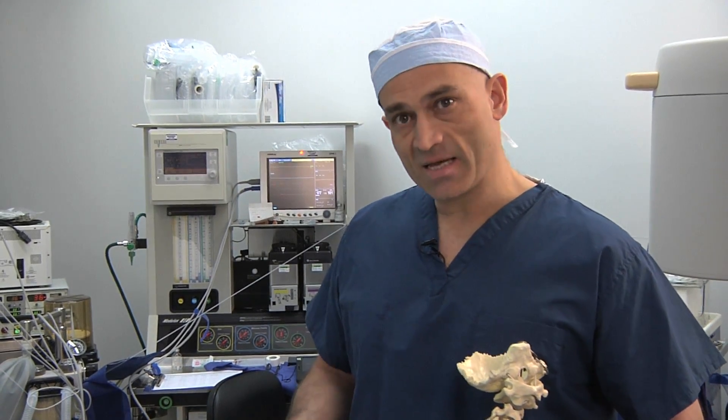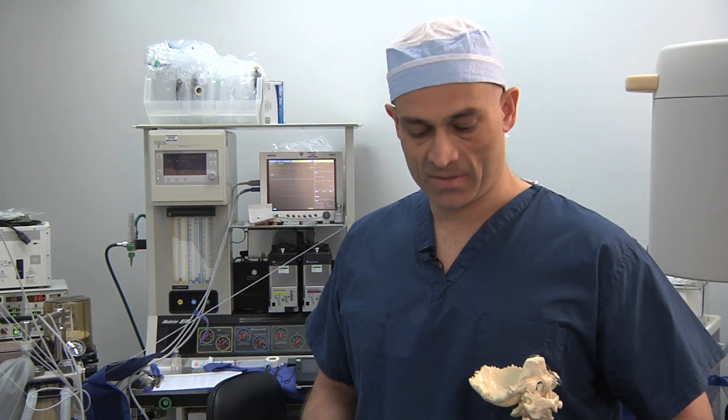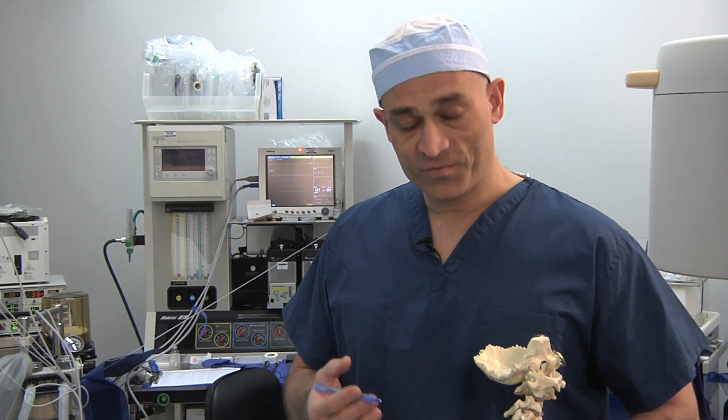Hello, I'm Dr. Richard Cull with NJSR, and today we're going to demonstrate a radiofrequency ablation of the dorsal root ganglia. It's a name for a procedure that we use to help people who've sustained injuries to nerves or have got inflammatory processes happening in the nerves, which can lead to leg pain.